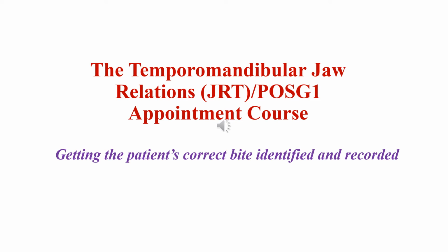This is the Temporomandibular Jaw Relations Appointment course, and we abbreviate that at the Atlanta Dental Group, JRT, Jaw Relations Temporomandibular. It's getting the patient's correct bite identified and recorded. In other words, we are moving the lower jaw around to a different bite position than their natural bite position.